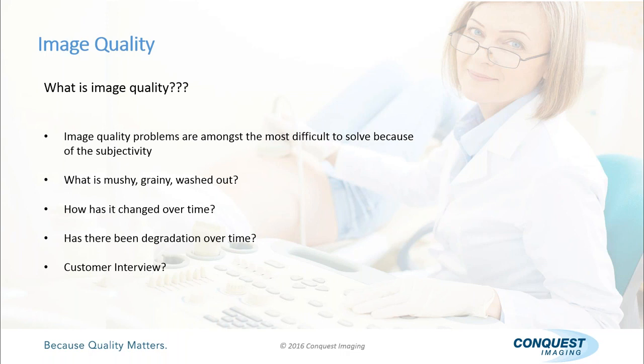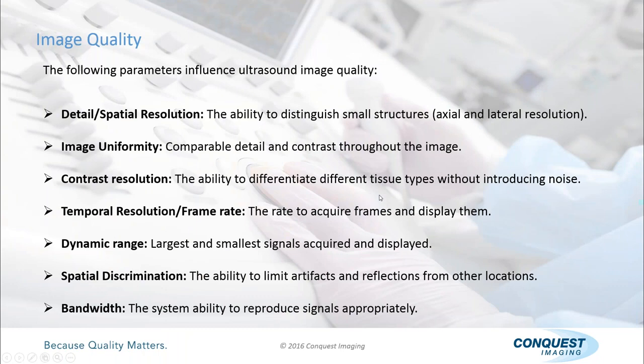And so I've decided that I have to go beyond just asking them what's wrong. I really need to dig for the answers of what they're describing when they are talking about image quality issues.